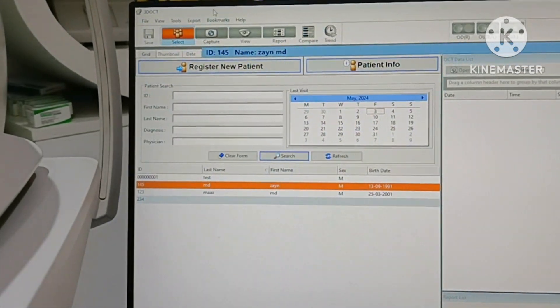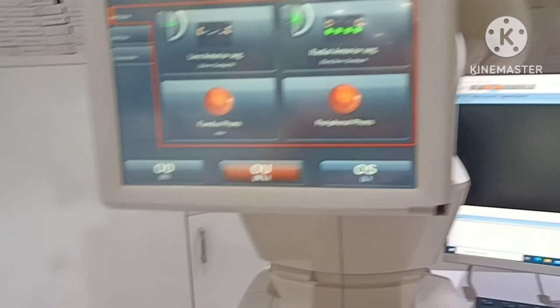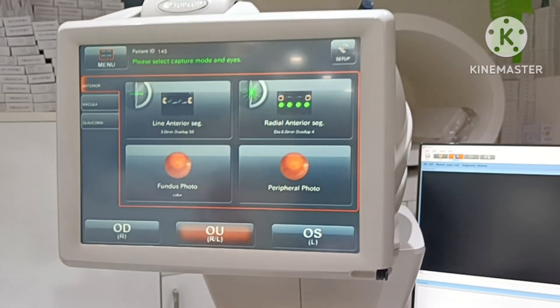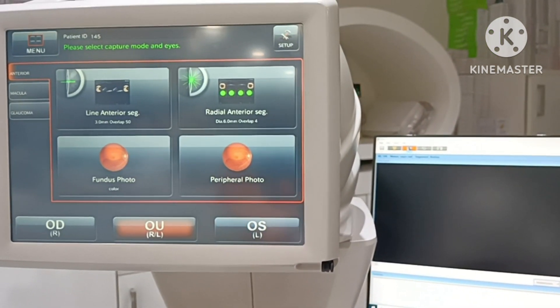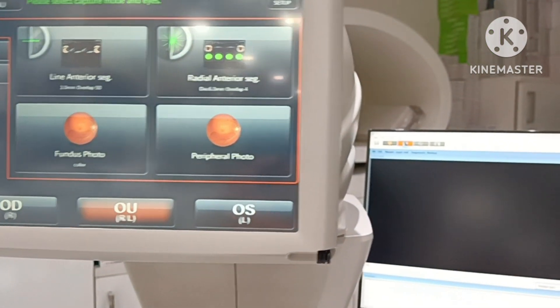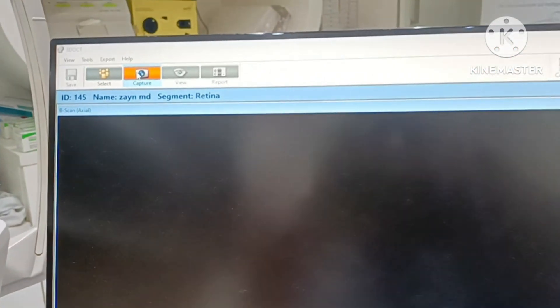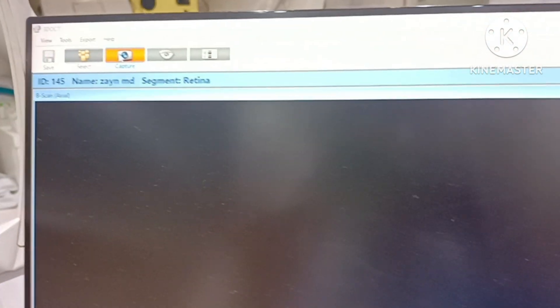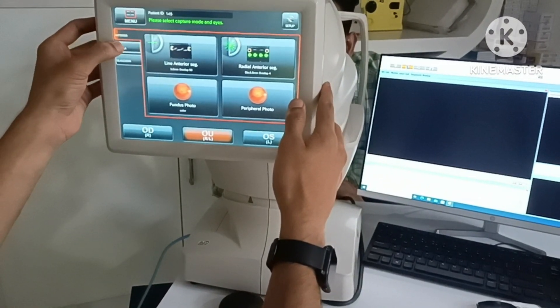Click capture. You can see the display is on. Now I will turn off all lights so that the reading will be more clear.